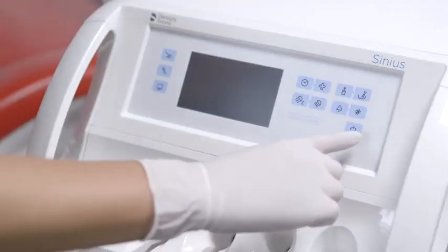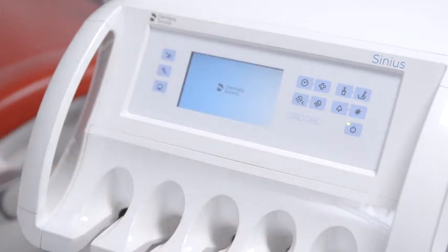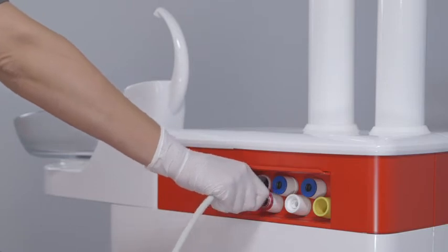After switching on the treatment center, the disinfectant for the water lines is rinsed out of the instrument hoses and tumbler filler with water. Sanitation is completed with step six and the instrument and suction hoses can be returned to the dentist and assistant elements.